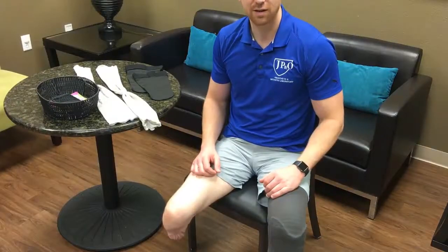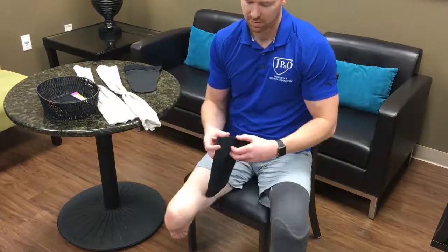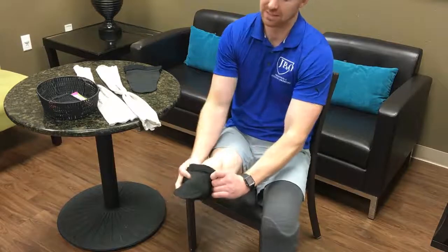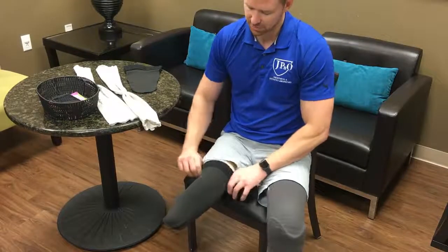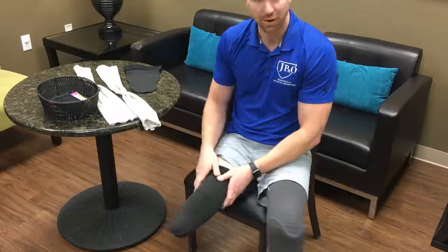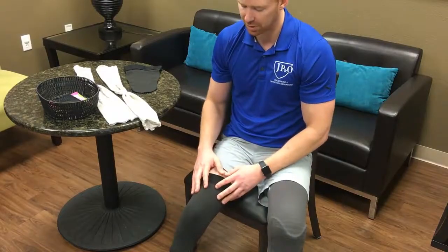The first shrinker sock I'm going to show you is the 4-way compresso grip. The way you put this on is to simply slide up the sock as high as it will go. It has material that will stick to your skin, that way it doesn't slide down. Make sure all the wrinkles are out of it, and that's the way it should look.